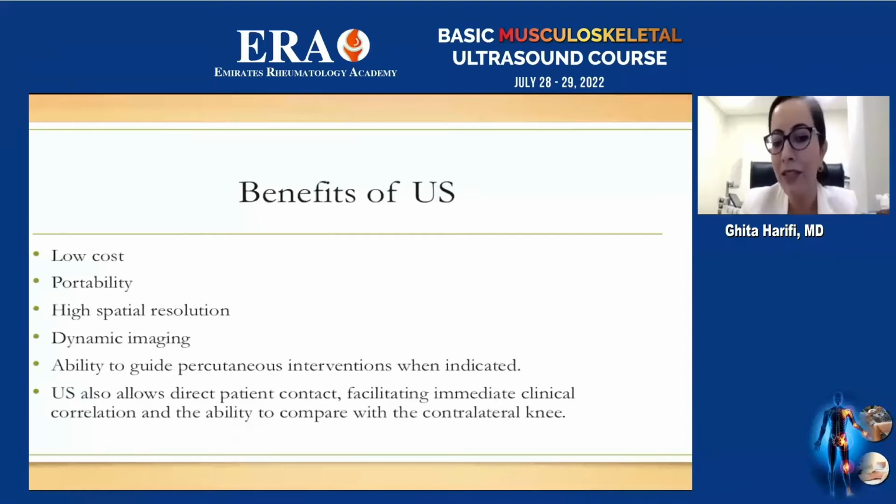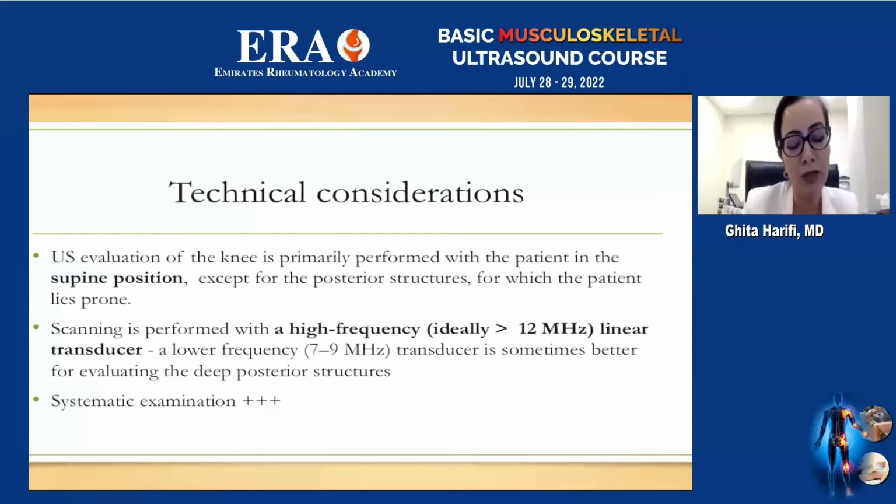It does facilitate an immediate clinical correlation. You examine the patient clinically, then you show him what is going on the ultrasound immediately afterwards. It offers also the possibility to compare with the contralateral knee, which is more complicated when it comes to the MRI.